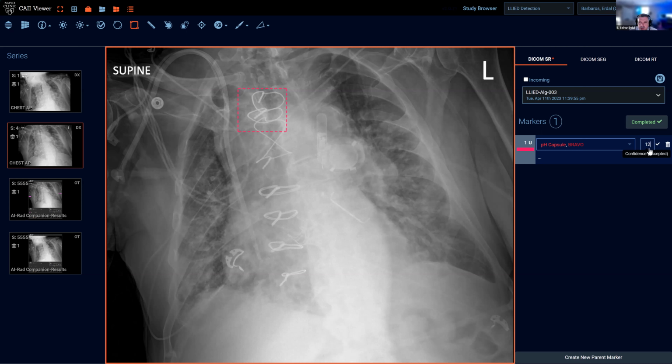So that's why it was so crucial for us to be able to tie MONAI and a code base like OHIF together, such that we can deliver the content at the time of inference, and receive the feedback at the time of inference with the physician's help, because they are the ground truth in this case. They set the ground truth. That was our logic behind our design philosophy here.